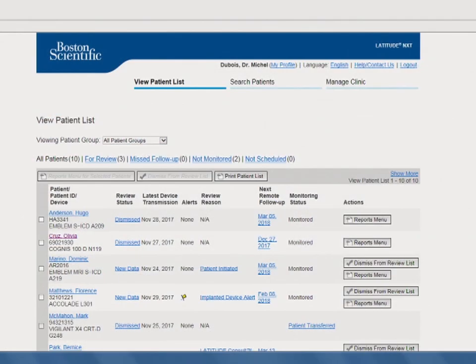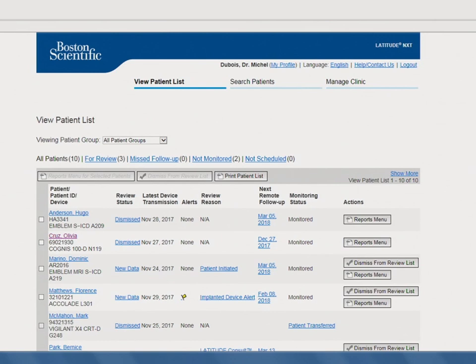As we mentioned earlier, in certain situations a patient may need a new communicator to monitor their new device after a changeout. When a new communicator is required, messages will appear after updating the implanted device model and serial number.